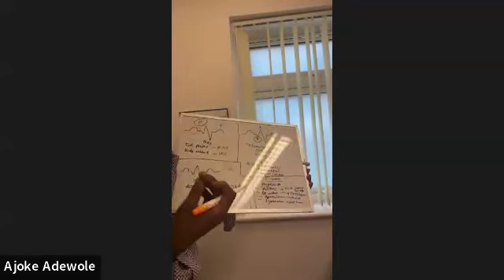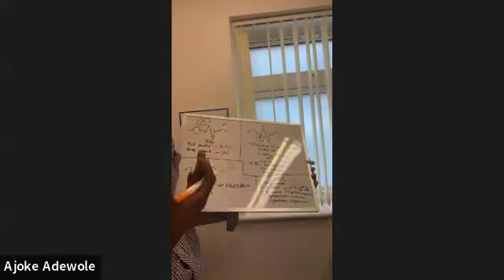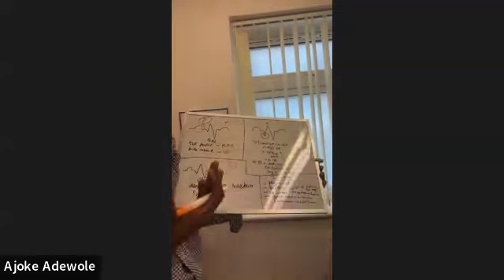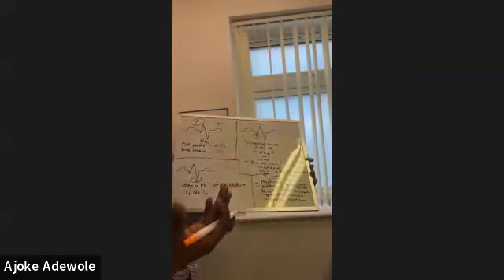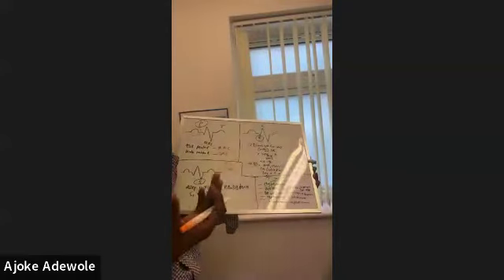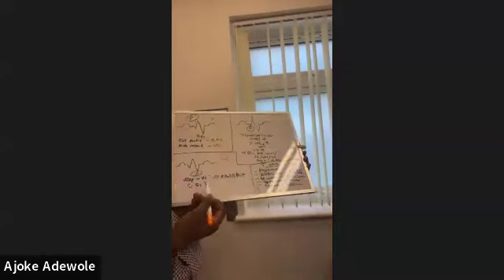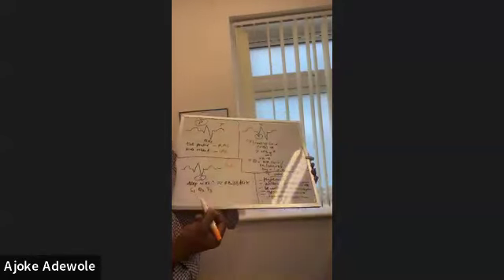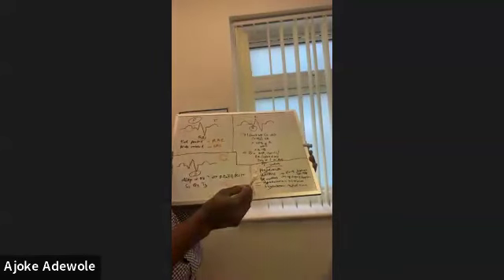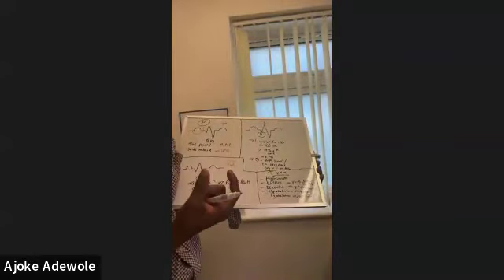When do you have hypertrophy? You have hypertrophy when there's a big heart, right? Or there's a problem with the structure of the heart. It has thickened from maybe doing too much work, from hypertension or from other problems, right? Or impulses are not passing through because maybe that part of the heart muscle is becoming dead or stiff. So basically, you also want to talk about your S wave when you talk about your S1, Q3, T3. Remember your PE.